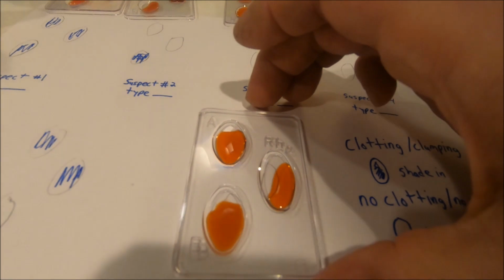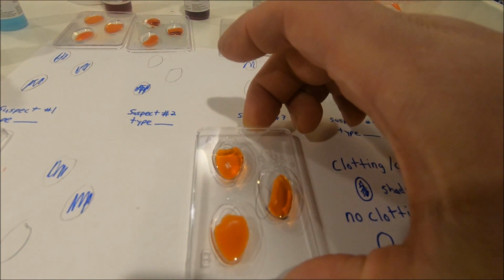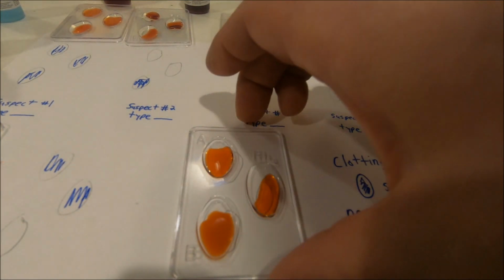And finally, our victim: nothing in the A chunking-wise. B, there's some clotting, and the RH, no clotting.